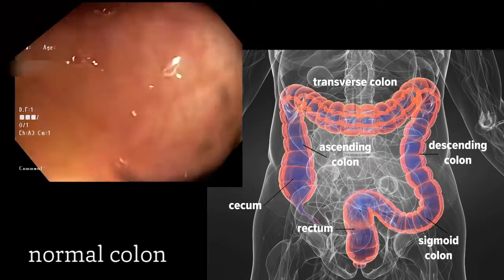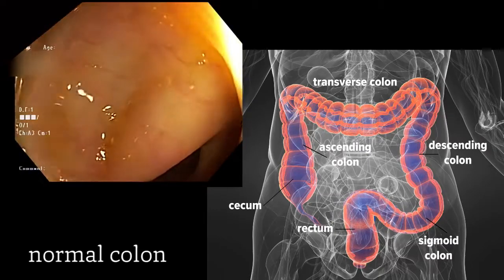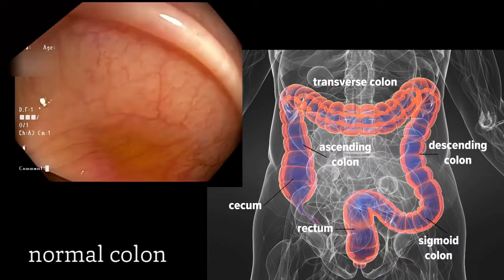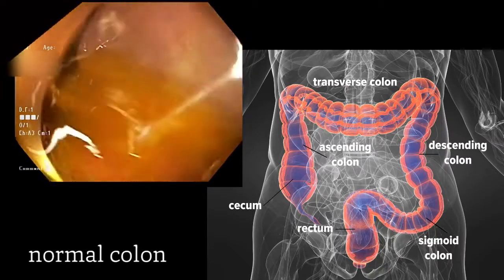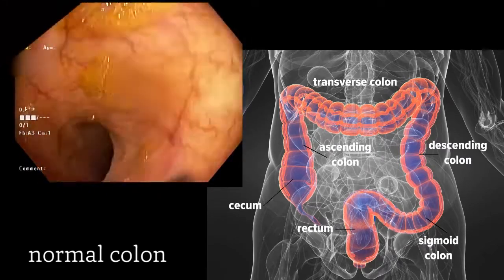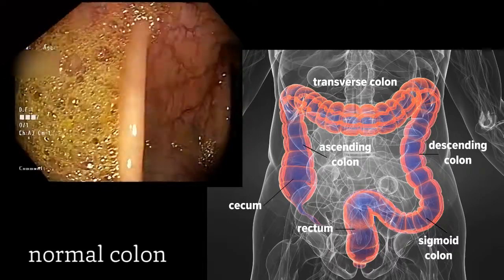You'll notice as we move along that the colon is characterized by a nice pink mucosa. And if you look very closely, you can see veins along the mucosa. The colon is not straight — in fact, there are a lot of twists and turns that you'll see as we move along. This patient did a great job preparing for the exam by taking a bowel prep. You'll notice there is very clear liquid inside the colon instead of brown and solid stool.